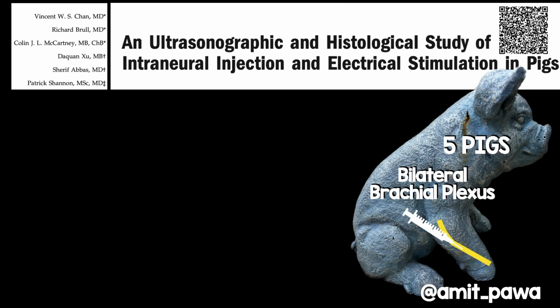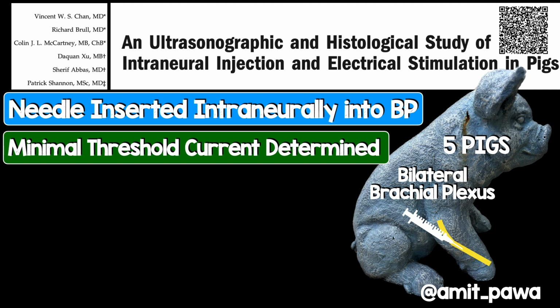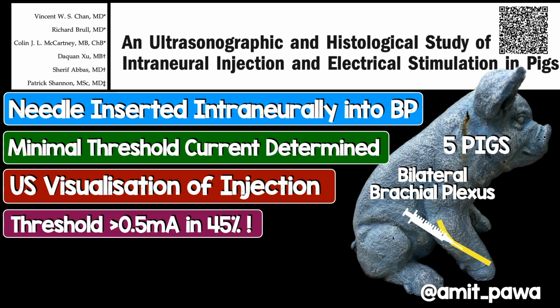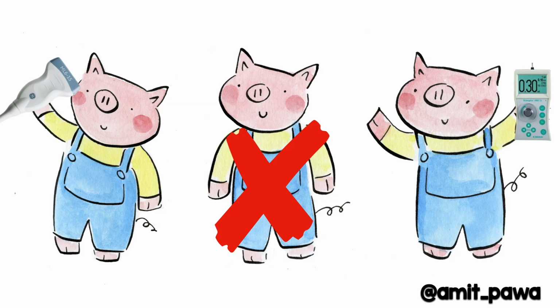Now, this next study, carried out by some names that you may recognize, was performed on 5 pigs, this time looking at bilateral brachial plexus blocks. The needle was inserted intraneurally into the brachial plexus and they aimed to determine the minimum threshold current, and they also then visualized under ultrasound the injection taking place. Now, what they found is in 45% of these cases they required a threshold current of greater than 0.5 milliamps, even though the needle was inserted intraneurally, and ultrasound was good enough to be able to detect just 1 ml of this intraneural injection.